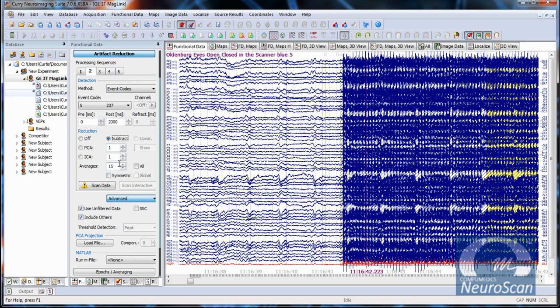Offline, we can increase the number of events that go into the average because they are distributed around the epoch to be corrected. When we're online, all of the events that are used to correct the artifact occur prior to the event of correction. But when we're offline, the algorithm switches slightly. So for example, in this particular case where we have 15 averages going into the correction, half of those are from before the time of the event that is to be corrected, and half are from the time after, since we have all of this now available to us.